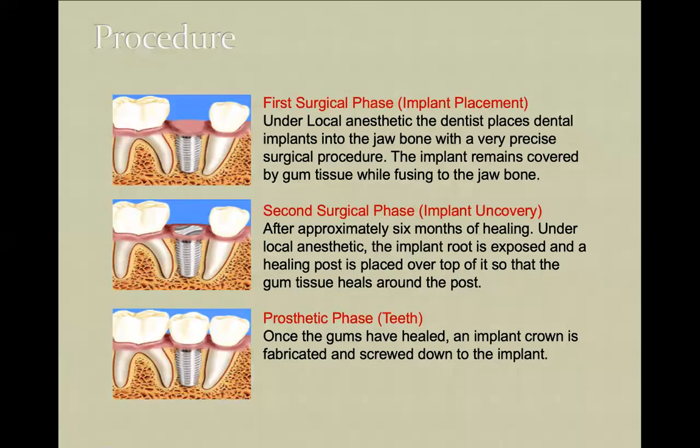Okay, now I would like to talk about the procedure itself. And believe me, it is very easy. It's easier than doing a surgical tooth extraction. Believe me, it is so. If it is not related with advanced procedures like sinus lift procedure or bone grafting or, I don't know, soft tissue reconstruction, if you're doing just single or maybe 2 or 3 dental implant placement, it's very easy.